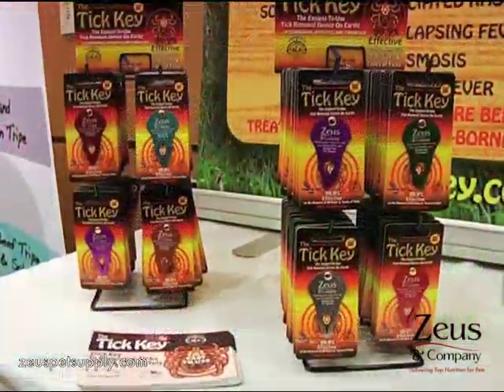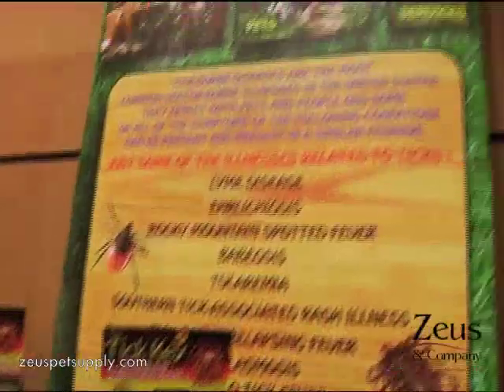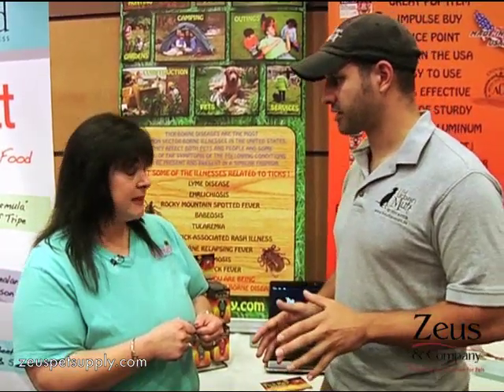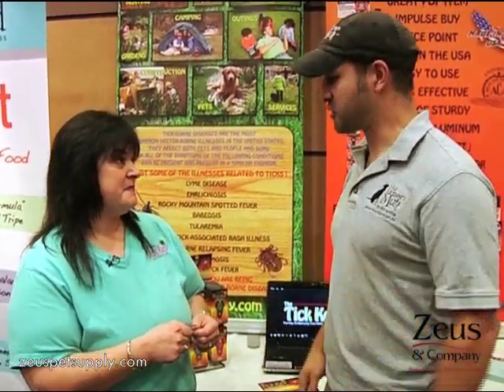And it works on most species of ticks — almost all species of ticks, from the tiniest ticks to the largest ticks. You get it out fast before it can transmit any diseases, and that's the important thing. That's absolutely the important thing. Very cool product.